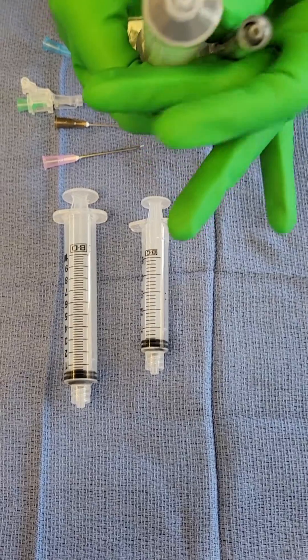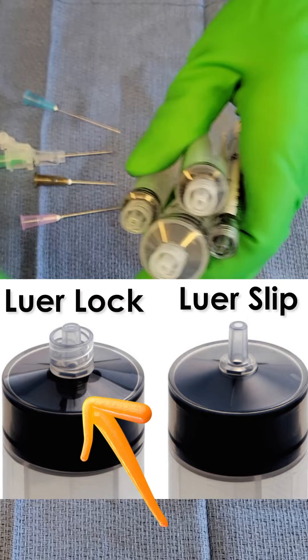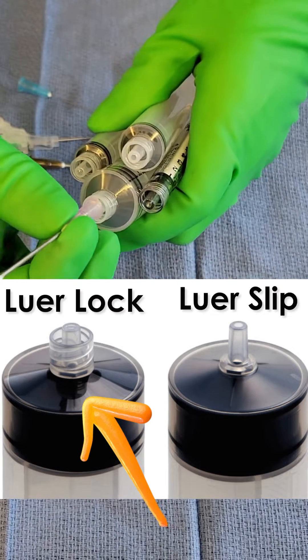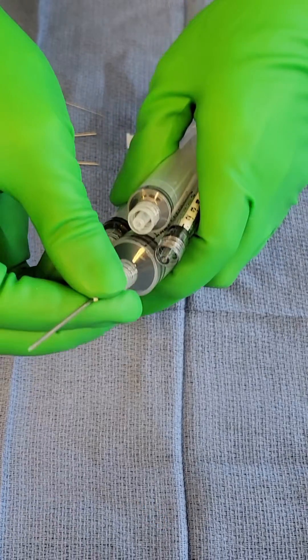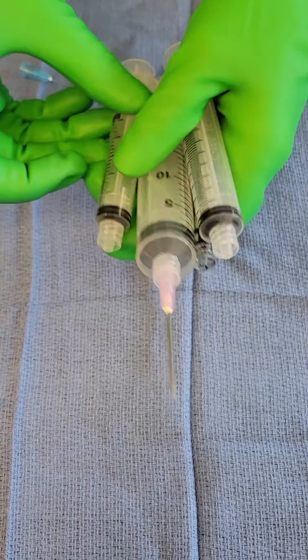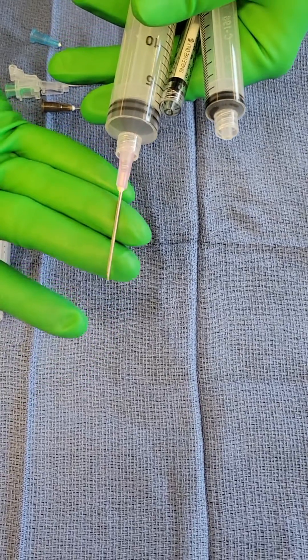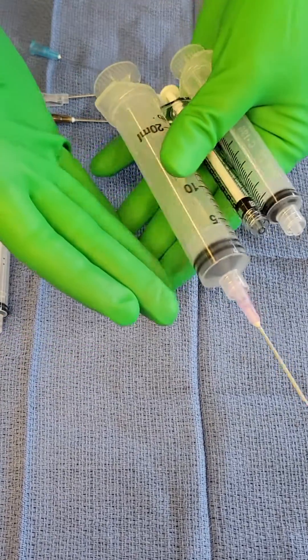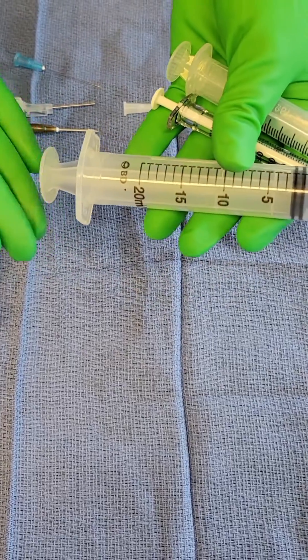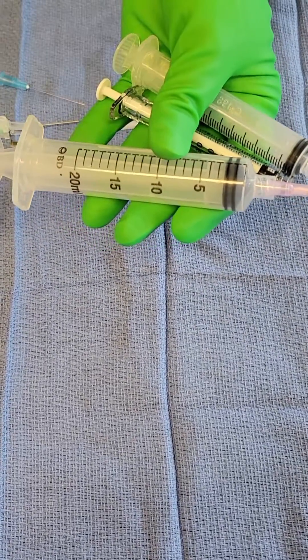Also notice all of these syringes here — they have what we call a luer lock tip. Luer lock tips easily match up so that your needle and your hypo are secure to each other. Remember, when we're talking about this part we're talking about the hypodermic, and when we're talking about this part we're talking about the syringe. Many times people get the hypo and the syringe confused.